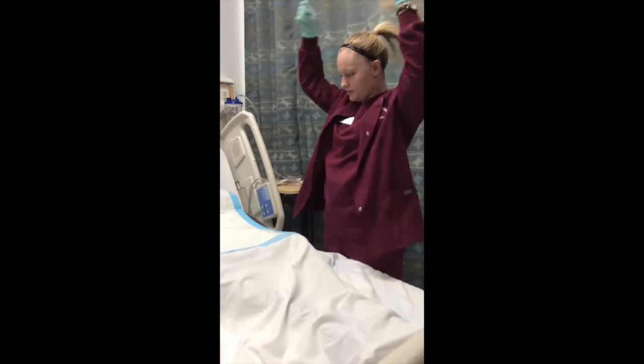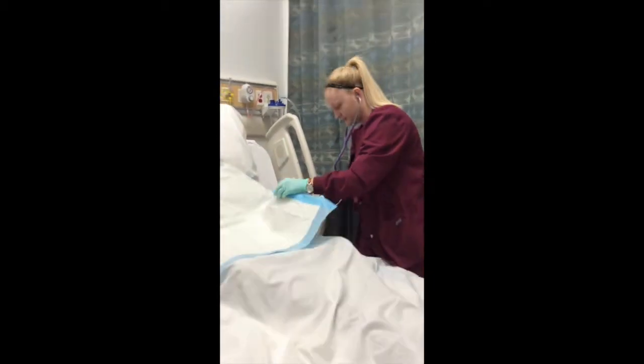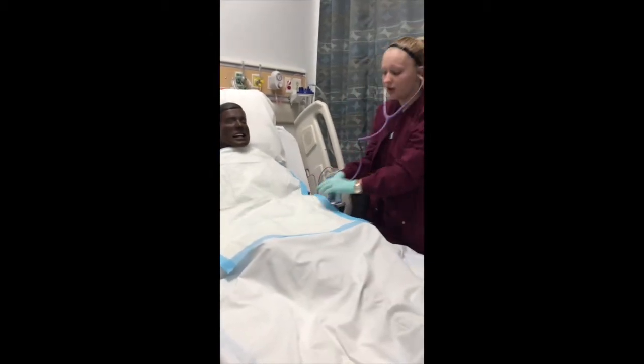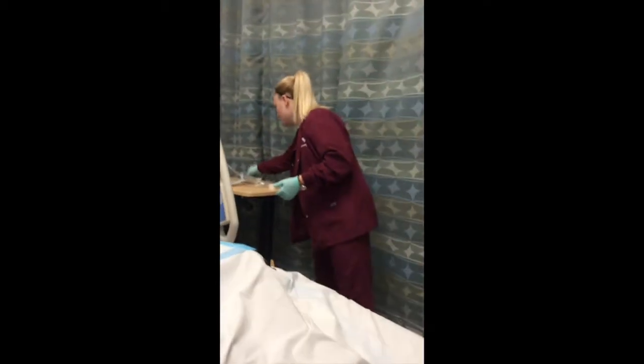So I'm going to listen to their bowel sounds real quick before I start this. And I hear that their bowel sounds are good in all 4 quadrants. So after I've listened to their bowel sounds and I've assessed all that I need to assess, I'm going to prepare to insert this tube.